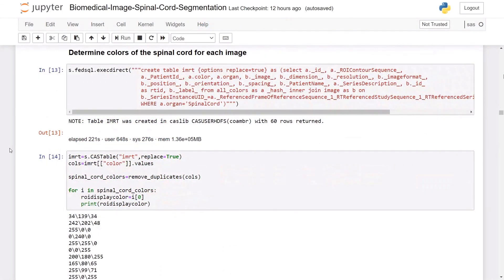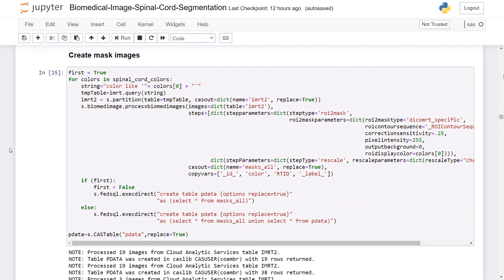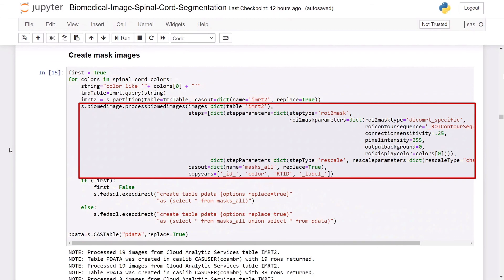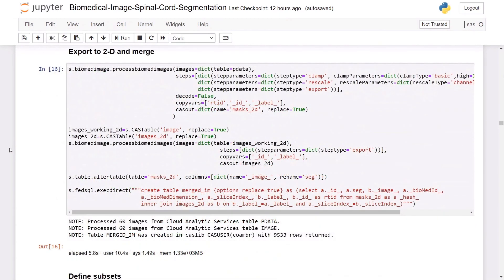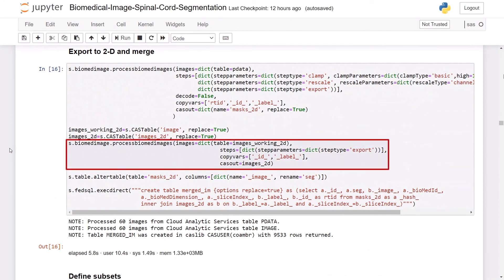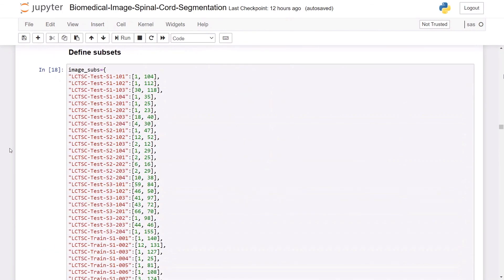Here I'm specifying that I want the colors of contours where the organ equals the spinal cord. The next step is to take the spinal cord DICOM RT contours and transform them into binary images that we can use for training and testing. These binary images will be labeled to show exactly where the spinal cord is within the biomedical image. For this task, I'll use the ROI to mask step of the process biomed images action. Because all the deep learning training and scoring will be happening in two dimensions, I'll also use the export step to export the three-dimensional images into 2D. Here I'm also defining subsets for the image slices to constrain the solution set and increase the accuracy of the pipeline.